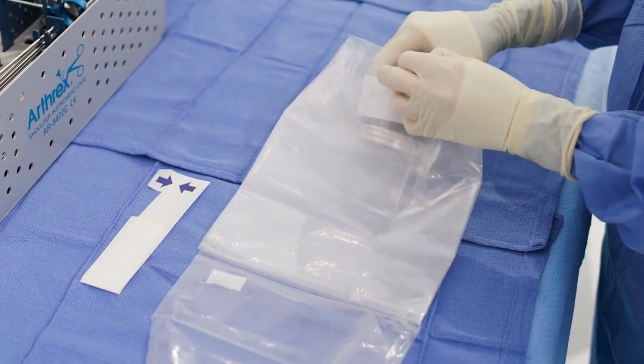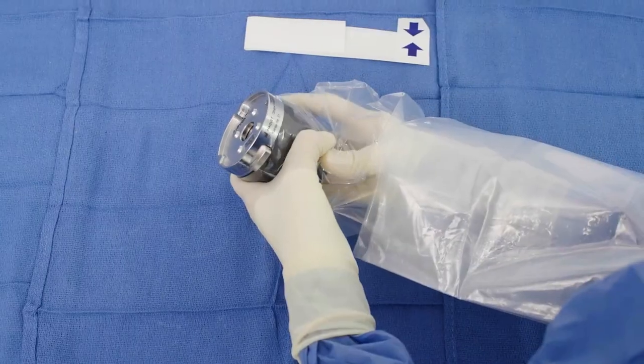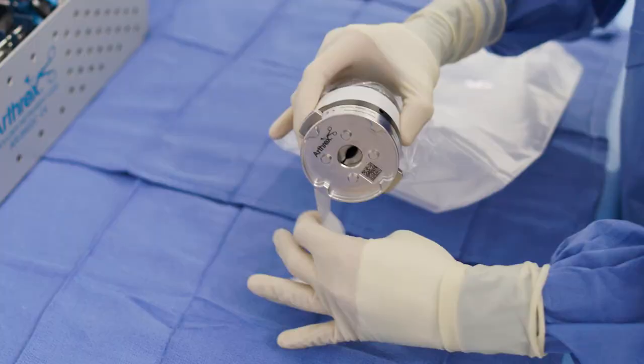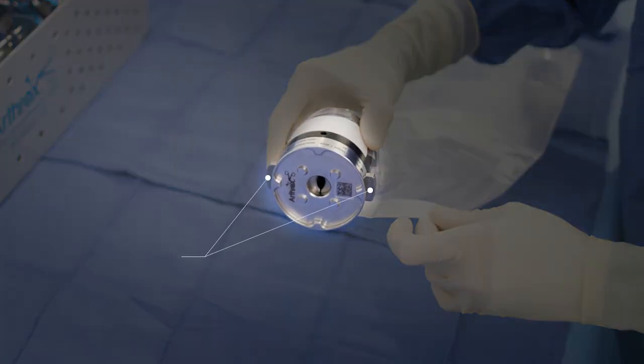Insert the adapter into the sterile drape. Tape the beginning of the sterile drape to the center area of the adapter using the adhesive tape. Do not cover the release buttons by the adhesive tape.